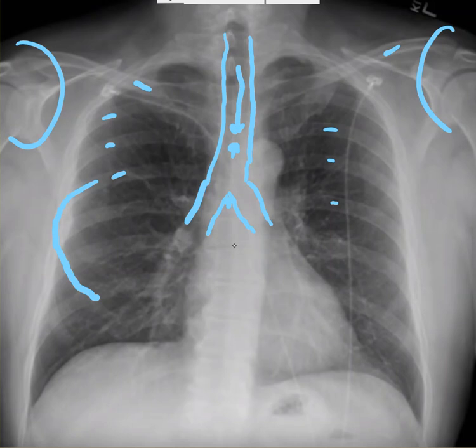The vertebrae you can see on a film that has decent technical quality. You can see vertebrae here, here, here — you can count down. I'm going to erase all these, then I'll show you how to count.